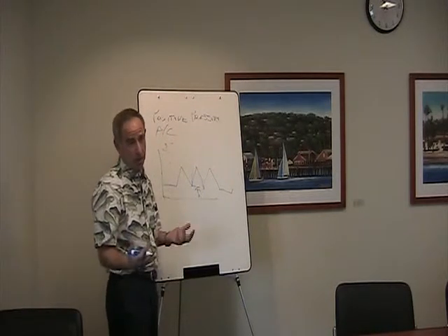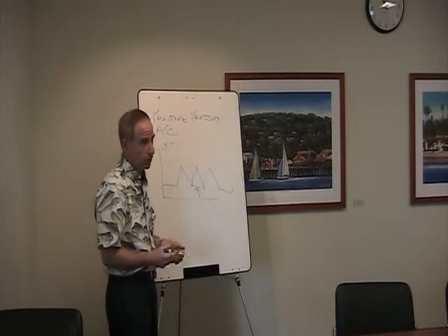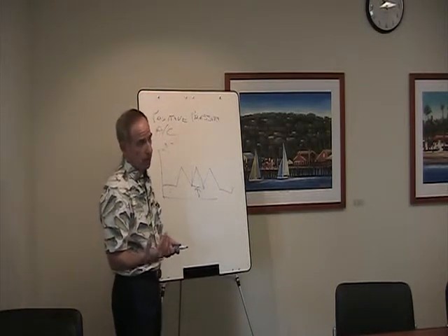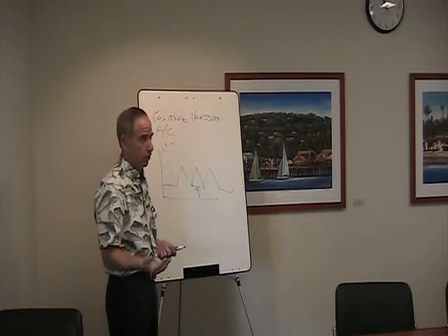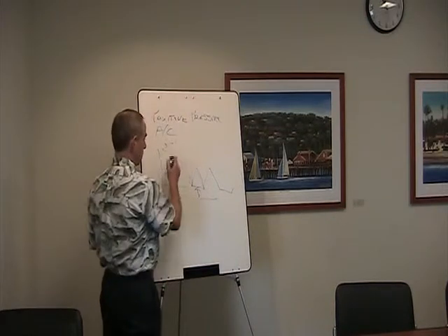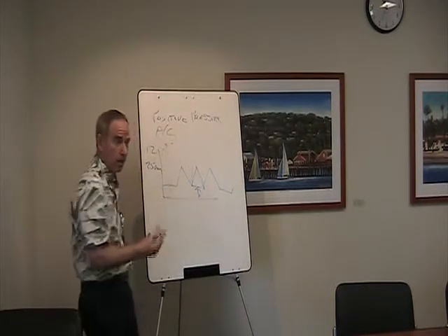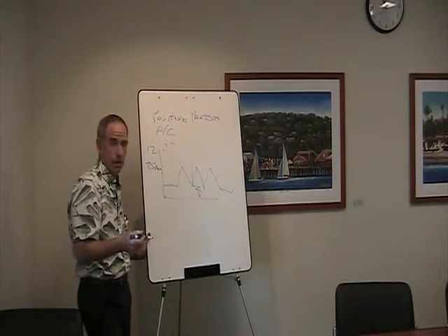So now I want to talk about pressure controlled or pressure cycled ventilation. So these initial ventilators use pressure. So you would set a pressure, not a volume. And what's the problem with a pressure cycled or pressure mode of ventilation? So if I set a rate of 12 and a pressure, say, of 25 centimeters, they're going to get 25 centimeters of pressure. How much volume will they get with that breath? Depends on their compliance. Okay, good.